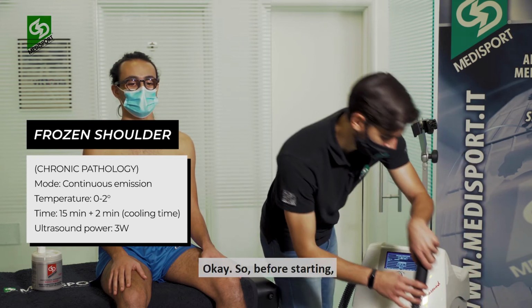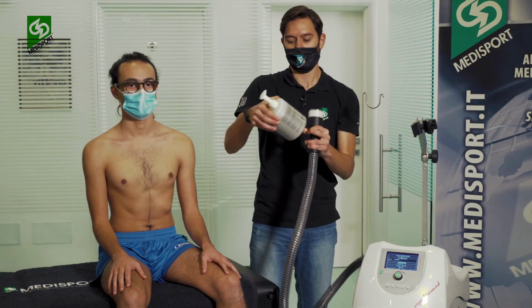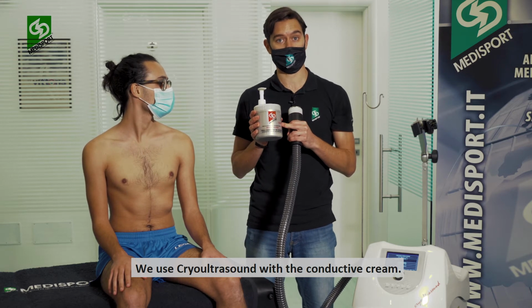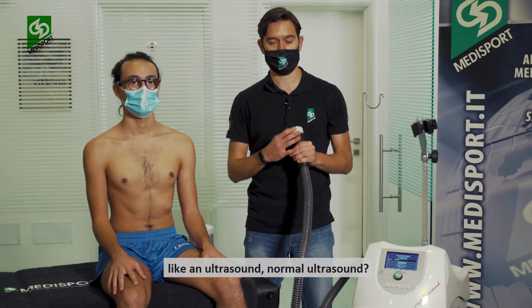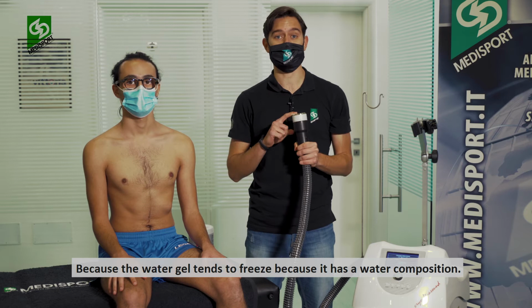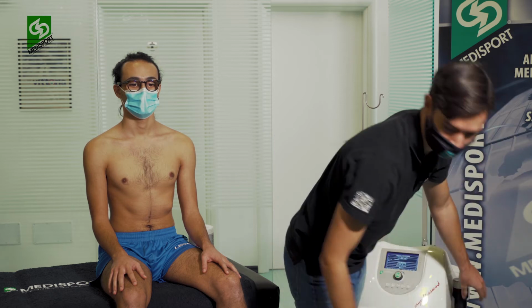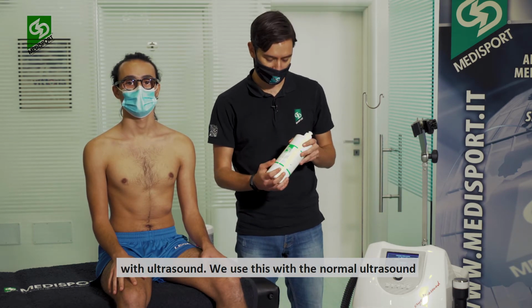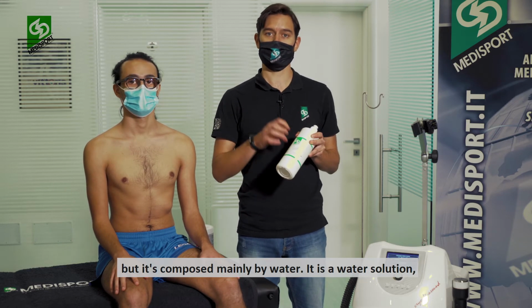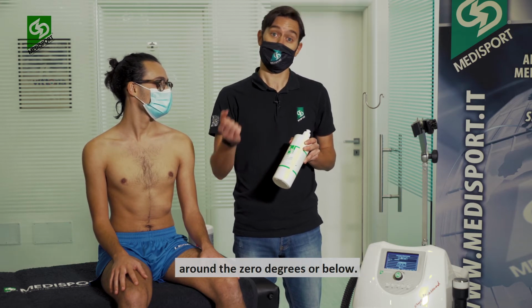Okay, so before starting, this is of course the headpiece that we said before. We use cryoultrasound with the conductive cream. Why don't we use the water gel, like a normal ultrasound? Because the water gel tends to freeze, because it has a water composition, and I will show you. So this is a normal water gel that you usually use with ultrasound. It is composed mainly of water, it is a water solution, so it will freeze when you set the temperature around 0 degrees or below.